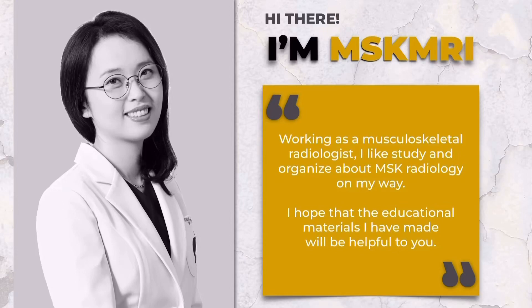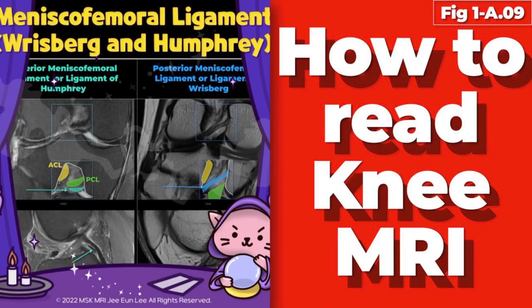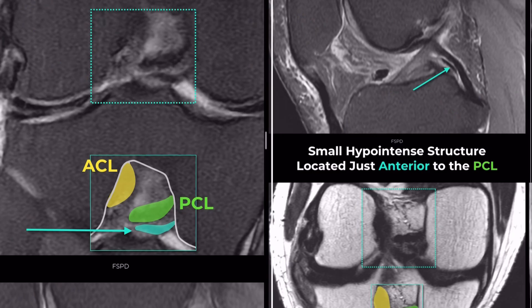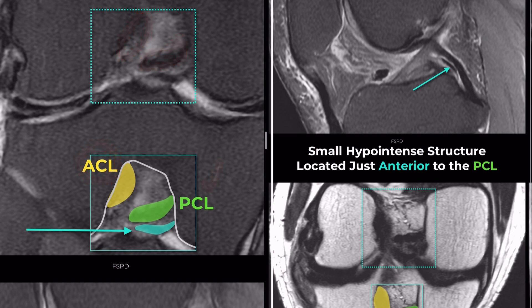Hello, I'm Zhiyunee from MSK MRI. Let's solve two quiz questions. For the first case, the yellow structure represents the ACL, and the green structure represents the PCL.